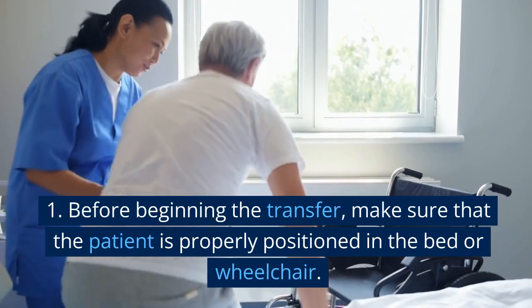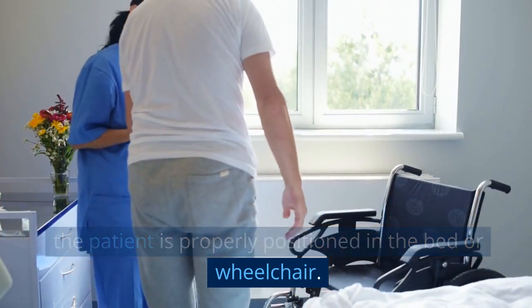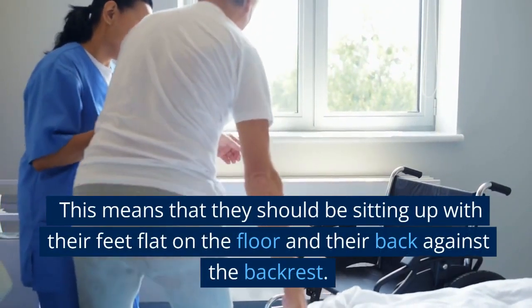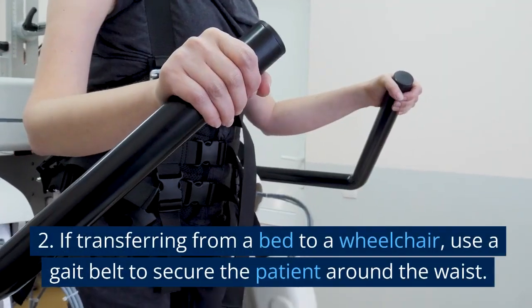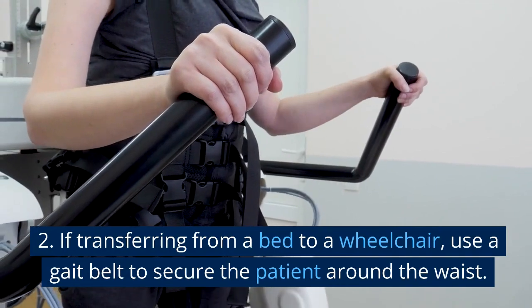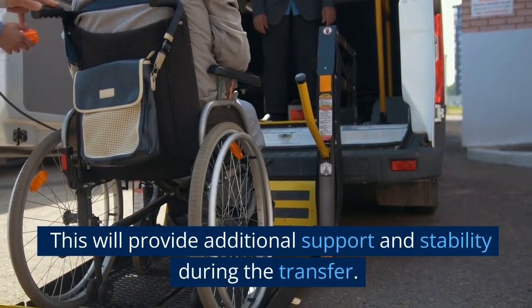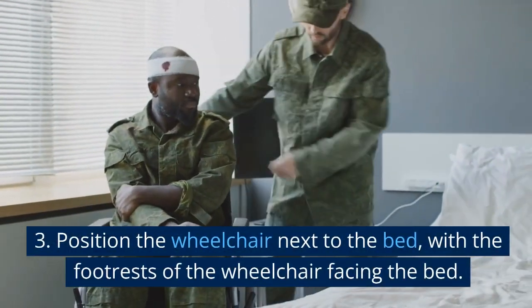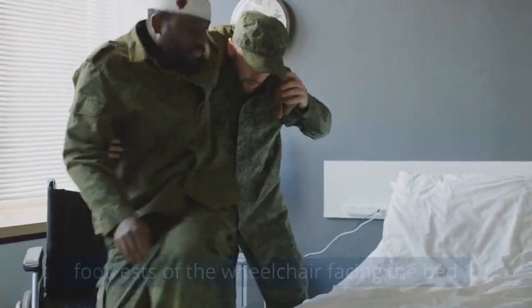1. Before beginning the transfer, make sure that the patient is properly positioned in the bed or wheelchair. This means that they should be sitting up with their feet flat on the floor and their back against the backrest. 2. If transferring from a bed to a wheelchair, use a gait belt to secure the patient around the waist. This will provide additional support and stability during the transfer. 3. Position the wheelchair next to the bed, with the footrests of the wheelchair facing the bed.